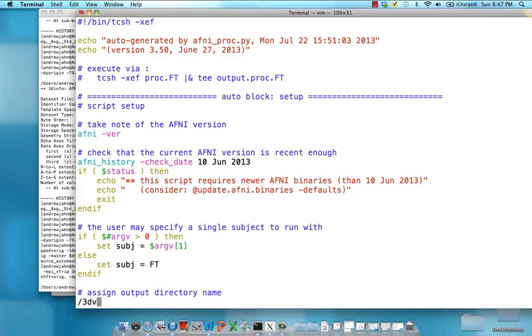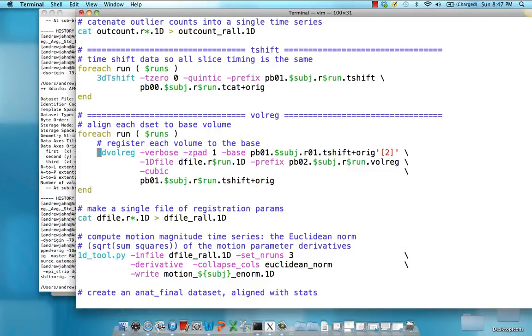In our proc script, this is taken care of by the command called 3DVOLREG. The important part is the base option, which specifies — at least in this example — that we are going to use the third volume of the T-shift output from run 1 as our reference image. It's going to remain stationary, and everything is going to be aligned to match it.